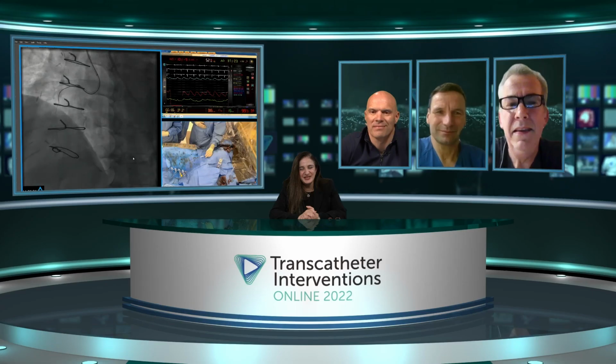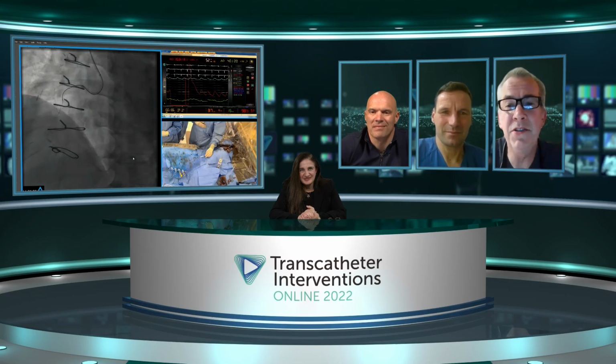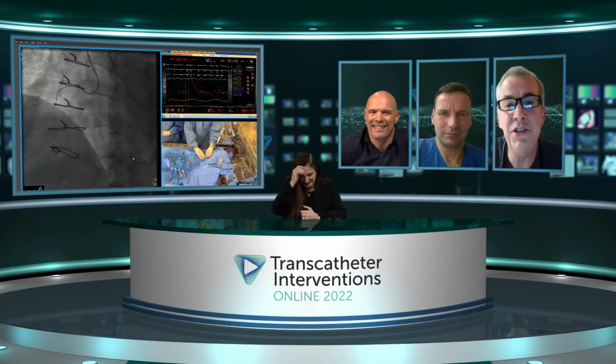Yeah, that's great. David? I mean, it was a pretty spunky case from the diagnostic pictures. I thought, ooh, that looks pretty tricky because there's no certainty of getting it antegrade. There was absolutely no certainty you could get down the retrograde channel. So hats off to them for attempting that.